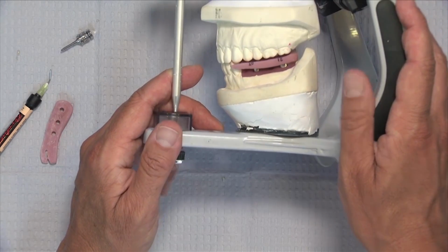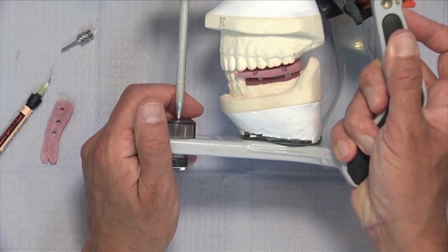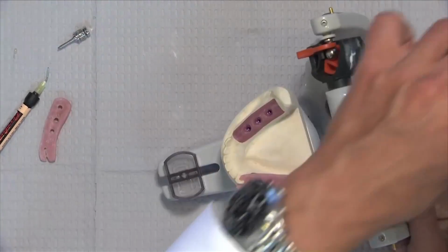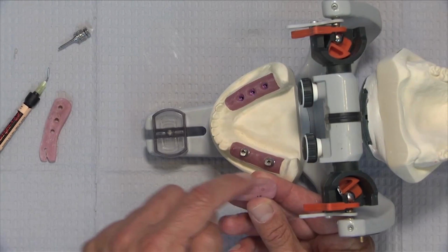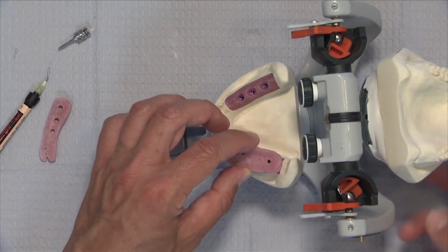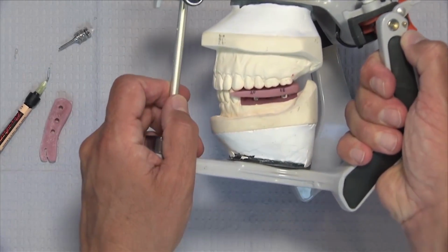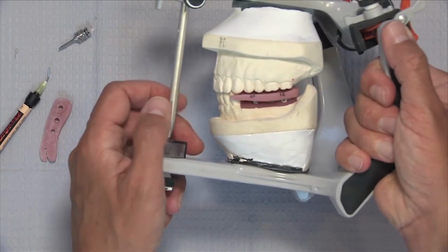I would say 90-95% of the time when the patient bites together into this index, they're not going to close smoothly right into it. And that's the whole point of this appointment, is to get a more accurate bite registration. So at that point, we take the index out and do what I've already done here with a watermelon burr, and that is grind away all the occlusal anatomy that was already there. What we want to do is assure that the patient is now freely biting together and closing, and you can see all the space that we have here between the opposing teeth and the guide itself. In fact, there's no contact at all. We want them to freely be able to close.